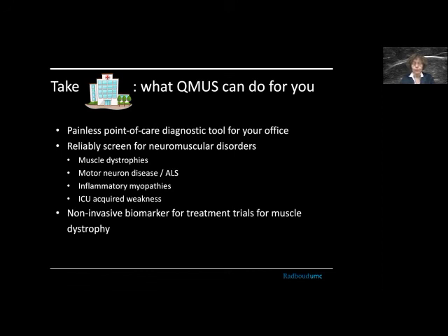It's quite reliable for muscle dystrophies, motor neuron disease, inflammatory myopathy, and on the ICU. And it's a very valuable tool, more sensitive than the clinical measures for treatment trials in muscle dystrophies.